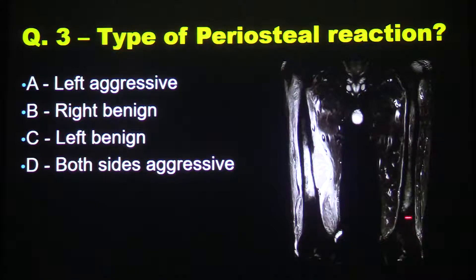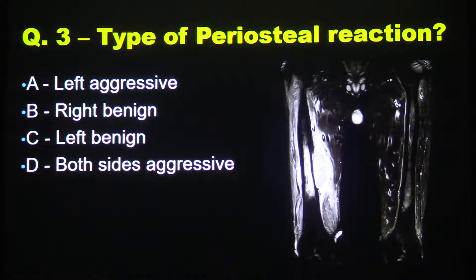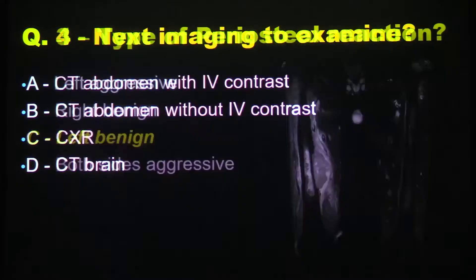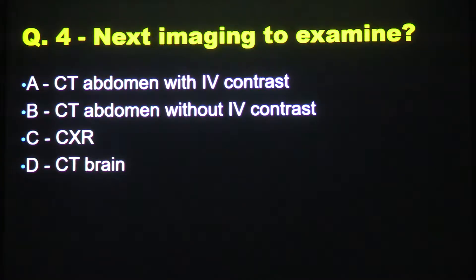So the periosteal reaction on the other side, the large lytic lesion with the soft tissue component, which we saw enhancing — this is the STIR. What we're talking about is a very wide periosteal reaction on the opposite side to a cortical lytic lesion with a soft tissue component. The periosteal reaction on the left side is benign and laminar. The idea for the next examination is actually part of the answer to the case.